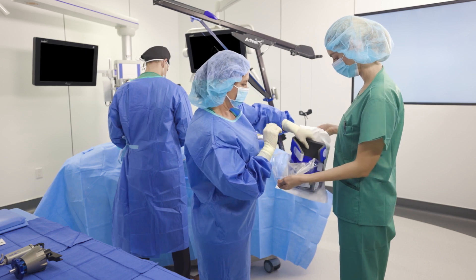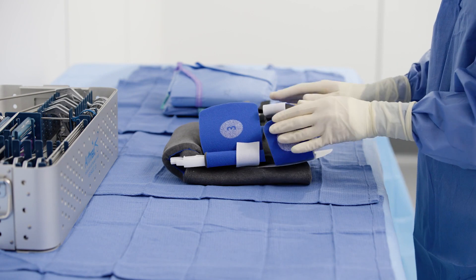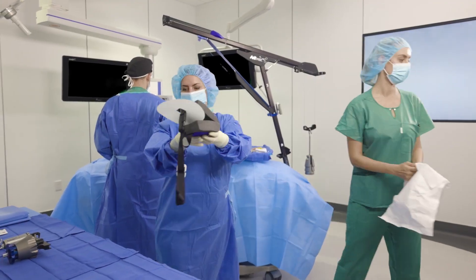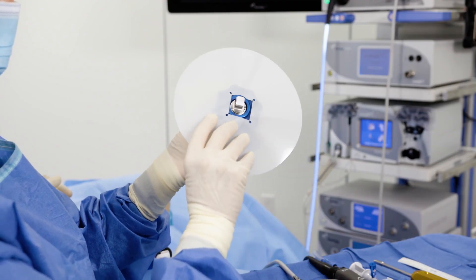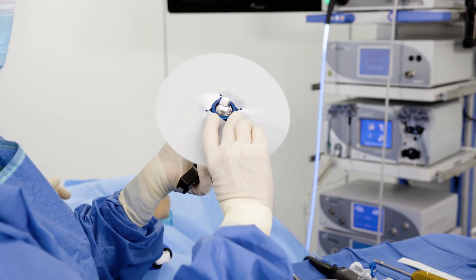Safely open the sterile disposable arm sleeve and keep it on the back table. For instability cases where joint visualization and access are required, open the lateral distraction sling as well. Both the arm sleeve and distraction sling come packaged with a sterile disc barrier. Attach each disc barrier to the autoclavable connectors.